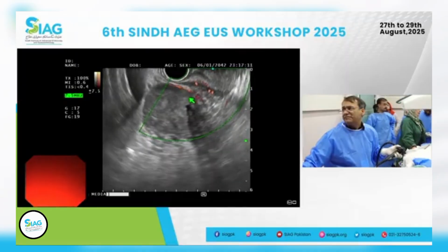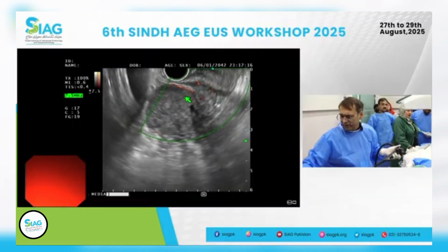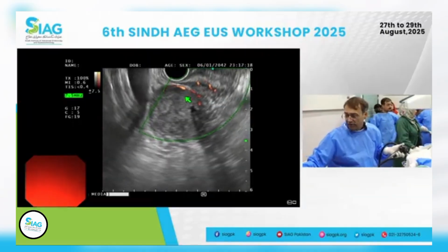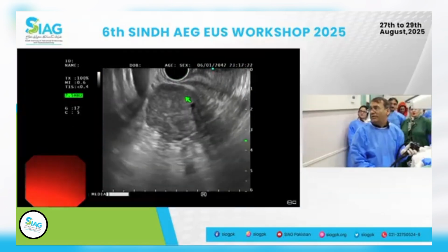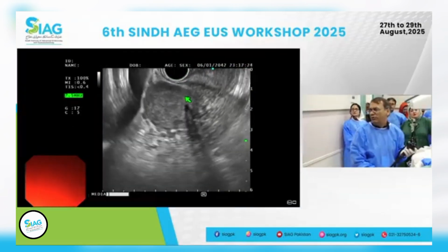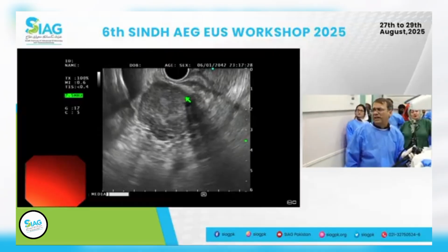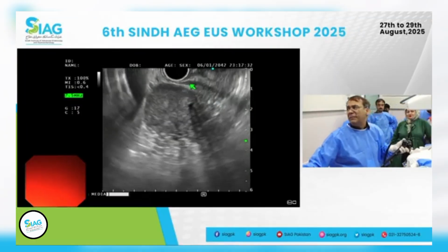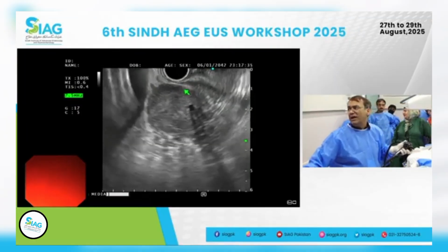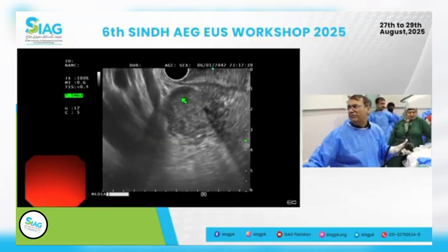Sometimes it's honestly better not to even see those vessels and not put a Doppler, it just makes you nervous. But if it's a big vessel, you don't want to go through that. In this case, I don't think it's going to make a major difference. If I need to make a third pass, I will still go right here, which is the easier part, then change the direction, big wheel away from you.